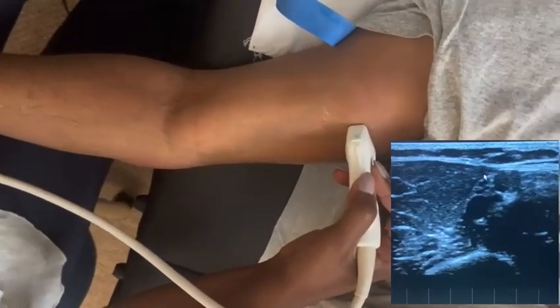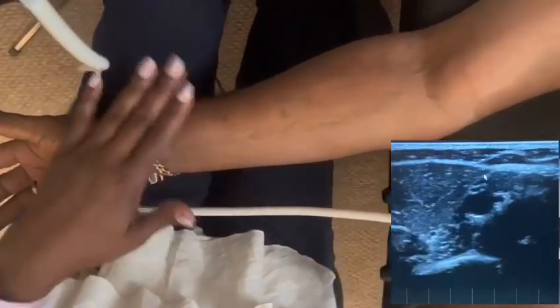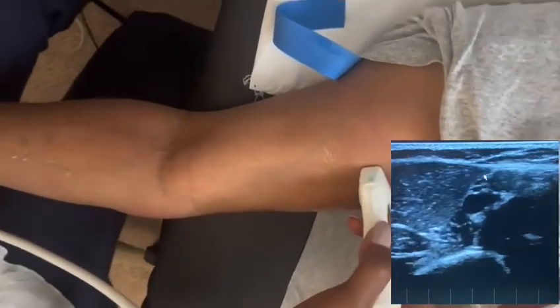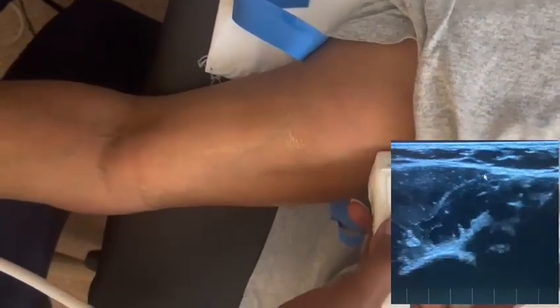It's okay to have the patient's hand on you. I usually do it to get comfortable. You can also put a sheet on your leg, put it on your lap, and then put their hand right over so you're comfortable and they are also comfortable.